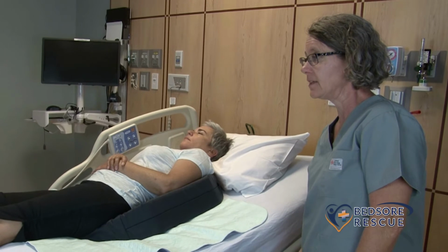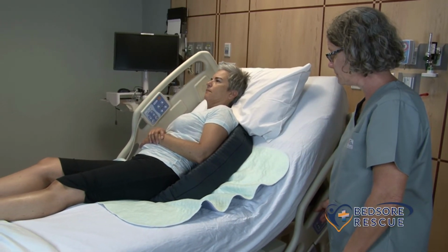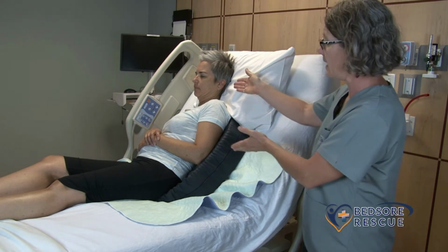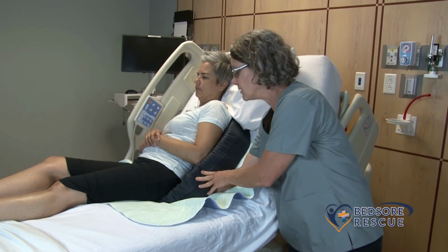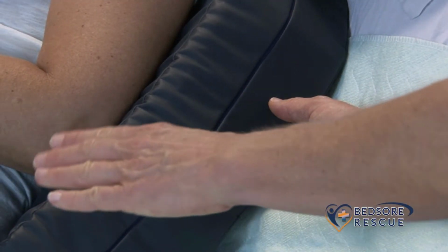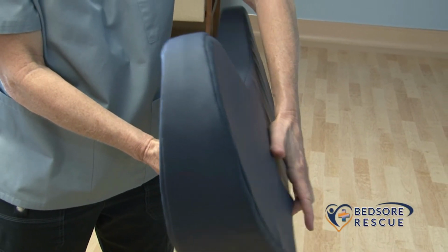Most people will have to have the head of the bed raised for things like eating and breathing, little things like that. Watch carefully what happens to the cushion as the bed goes up. What happened to the cushion? Nothing happened to the cushion. It stayed in place and she remained in her 30-degree tilt. You can still, of course, check to make sure that there's no contact on the sacrum, but the cushion is conformed such that it'll actually stay under her because it turns with her back. So even if she slumps down, she's still got the wedge under her and the wedge will go with her and keep the tilt.